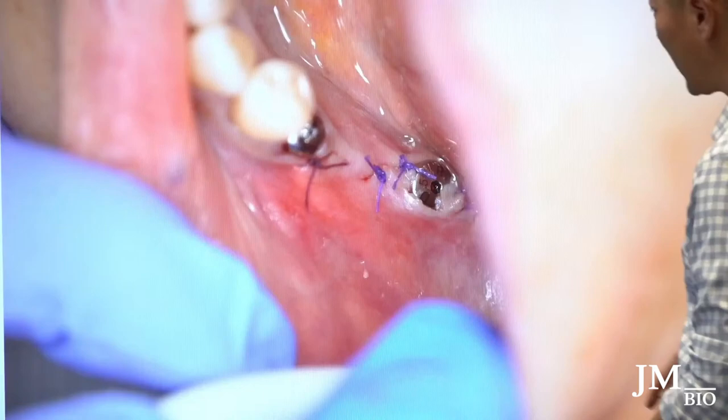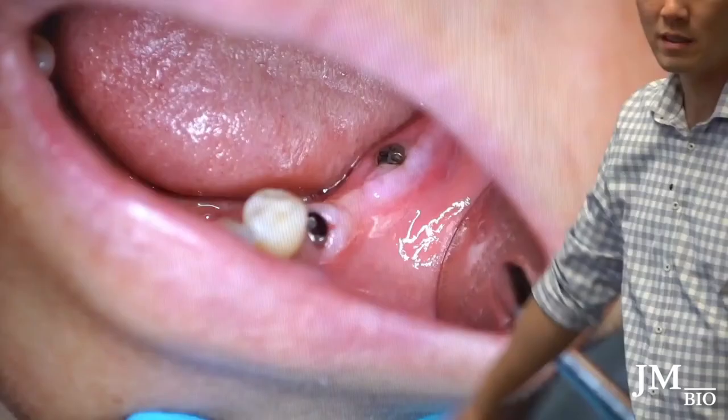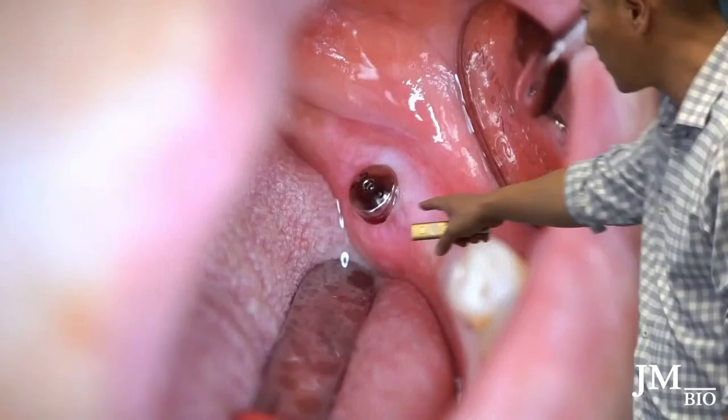I get closure but there's still a little bit exposed over the healing abutment — not a big deal. Two weeks later, look at the tissue: you can see the big, thick keratinized tissue building up. That's exactly what I want — that's the reason I did the case that way. The healing abutment is buried under the gums, so I switch it out for a taller one. That's the reason I like that lingual-crestal incision: you can bring the keratinized tissue to the buccal and add to the tissue volume.